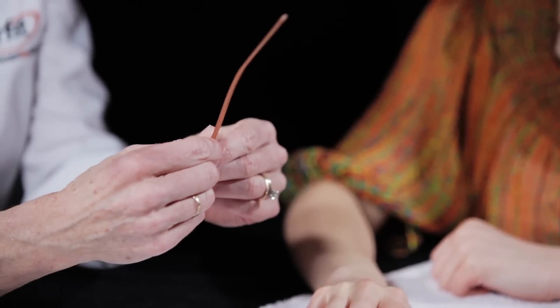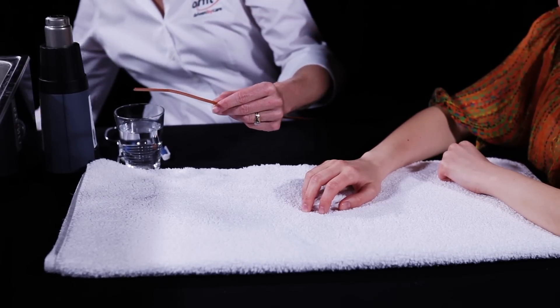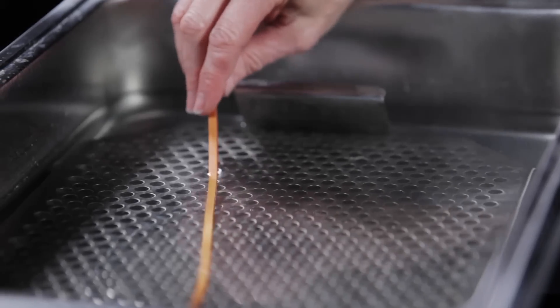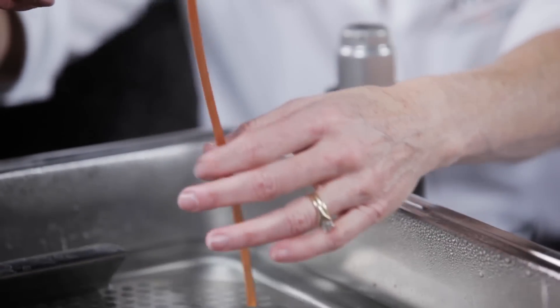Place an Orphid strip of 0.5 inch width in hot water at 65 degrees Celsius or 149 degrees Fahrenheit to activate. Remove the Orphid strip from the water bath and cut off about 3 inches or 8 cm length for this orthosis.